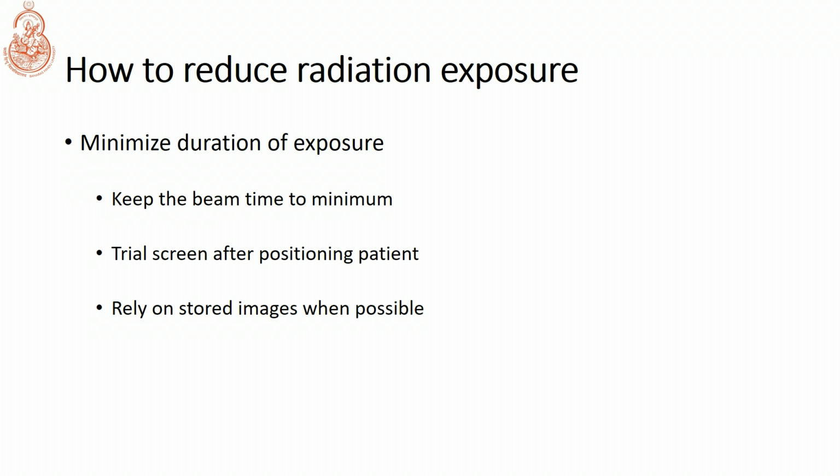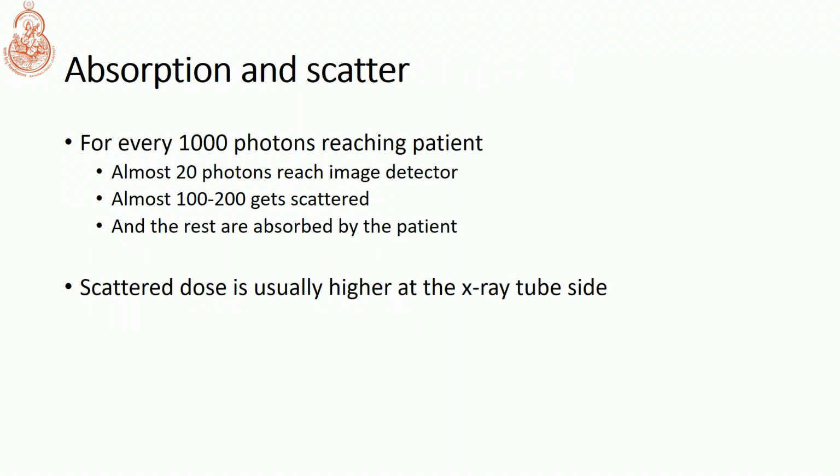So if you have certain stored images, make sure that you go back and see the stored images rather than repeating the C-arm procedure again and again, so that the radiation exposure is getting increased.